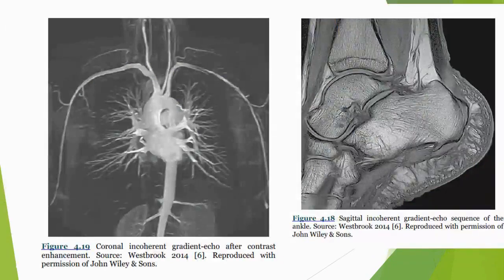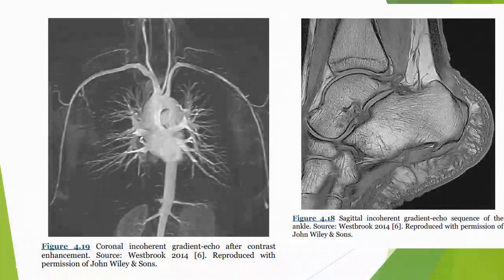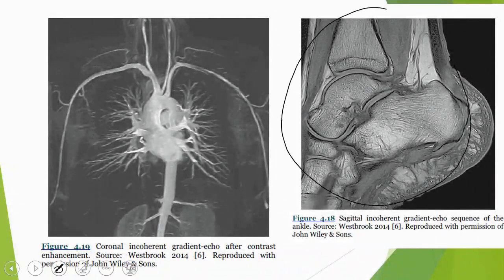May I ask about the application? I want to tell you that it provides you with an image that is almost more precise than a T1 weighted image. This image was made by myself using a sequence. In summary, this image is better for you than the regular T1 weighted image, as even in spin echo, it provides more information, more resolution, or a better signal to noise ratio.